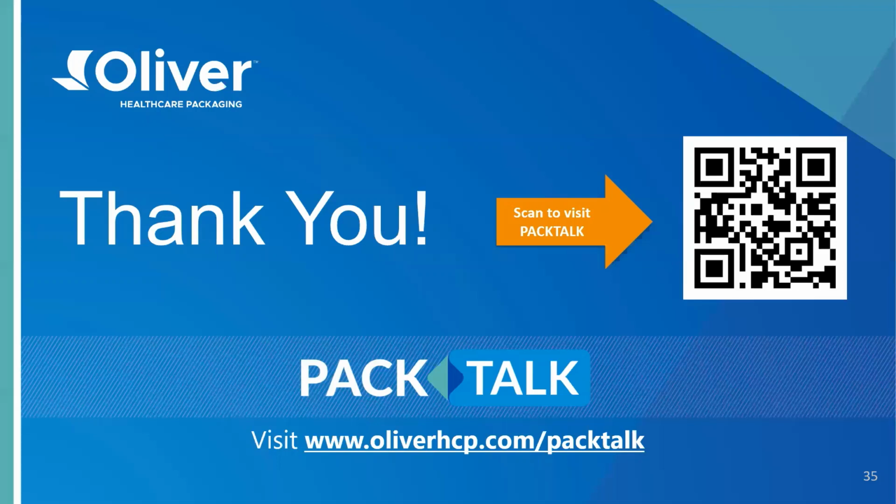Because if you have a double sterile barrier system and you only validate one sterile barrier of the sterile barrier system, then it's required to label which one is sterile and which one is not, to give the user guidance on what can be placed into the sterile field or not.